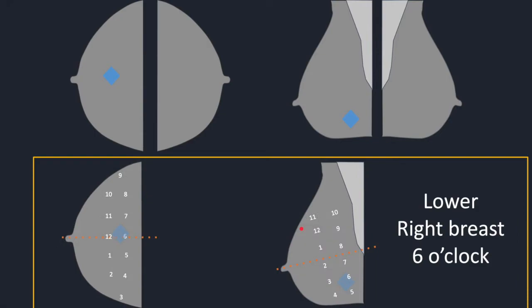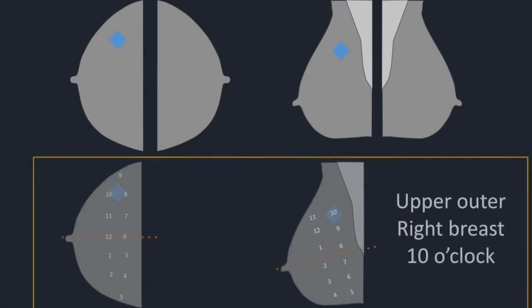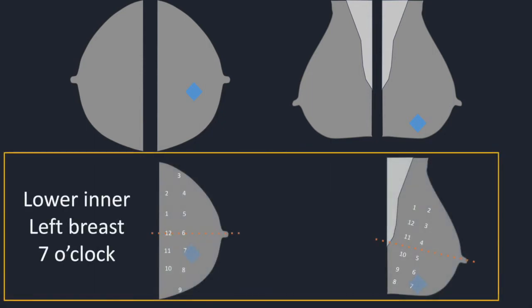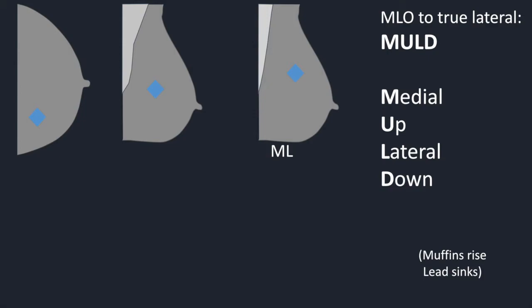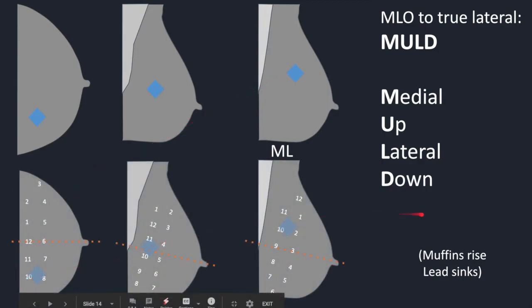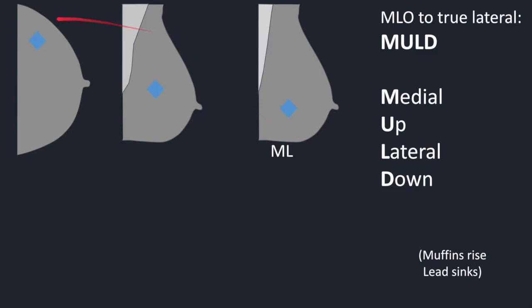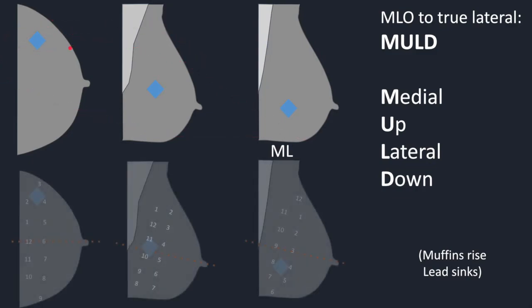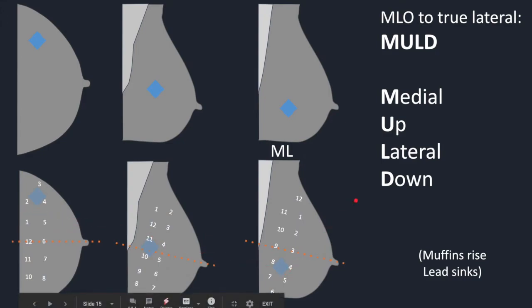Here is the corresponding example at 6 o'clock. I want to demonstrate how a lesion will appear differently from an MLO and an ML view. If the lesion is medial, it will appear to go up relative to the posterior nipple line. There is a somewhat confusing mnemonic — muffins rise and lead sinks — meaning medial things will go up and lateral things will go down. I just remember MULD: medial up and lateral down. Here is another example of the opposite, with a lateral lesion apparently going down when moving from the MLO to the ML view.